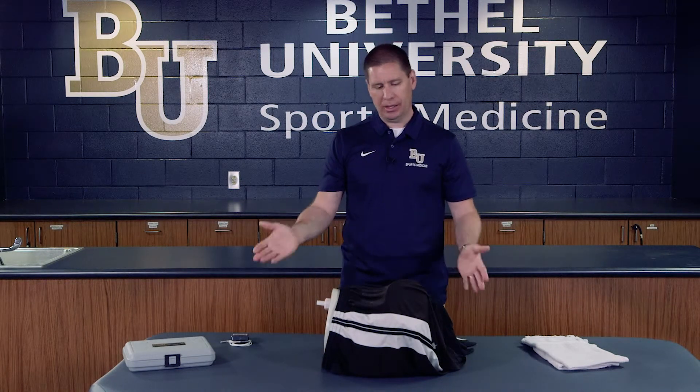The only truly accurate way to get a core body temperature is to do it rectally. We want to be fully prepared to do that, and in the event that their temperature is elevated, we would want to actively cool them down — you can learn that in the cold water immersion video that's supplied.